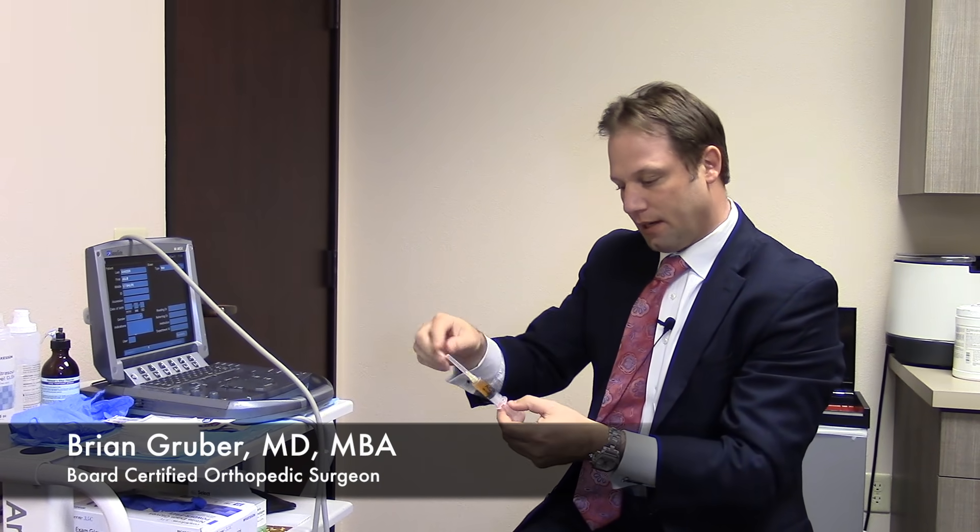So now we've spun down Julie's blood and we have the final product. This is actually the PRP, and she had a really good spin — so this is about five and a half cc's. We use a concentration of three times, which there's a lot of literature supporting as far as platelet concentration goes — three times seems to be a good number.